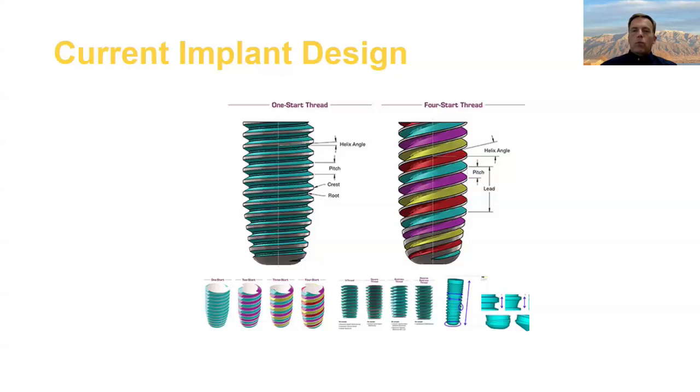When we're thinking about the material from which the implant is made, we want to make sure that it's strong enough to absorb the additional loads that it'll receive because of the lack of that shock absorbing function of the periodontal ligaments. And especially, you'll see some ads now for modern implants where they dip them in a vat of blood. You can watch the blood go halfway up the threads. So having them be so hydrophilic really helps with blood penetration and then osteogenesis.